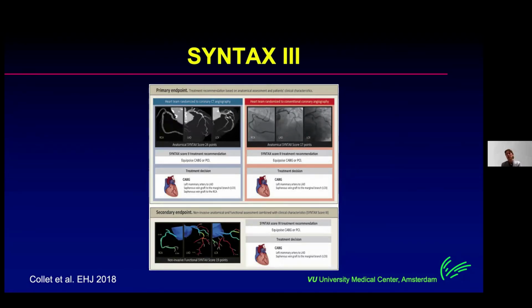So in 93% of cases, the heart team decision in terms of 3-vessel disease was exactly the same for invasive coronary angiography as compared to CT-based coronary angiography. So we're now moving into an era where we no longer need to inject contrast dye and puncture patients to see what their coronary angios look like and whether we should or should not perform intervention.